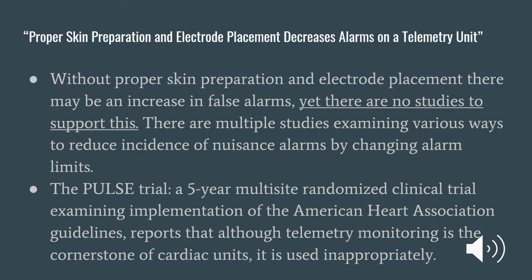This study also talked about the PULSE trial, a 5-year multi-site randomized clinical trial examining implementation of the American Heart Association guidelines. And it reported that although telemetry monitoring is the cornerstone of cardiac units, it is inappropriately used.